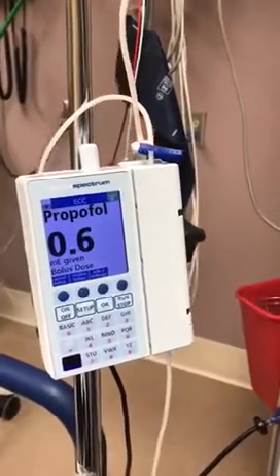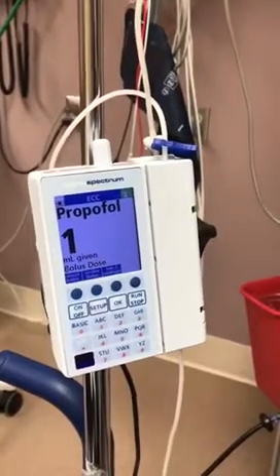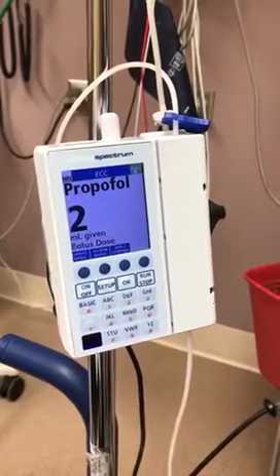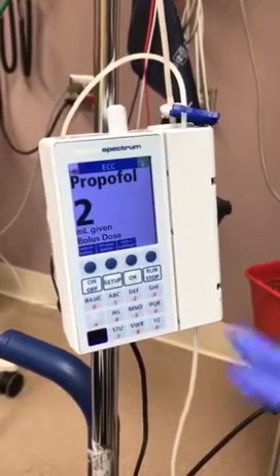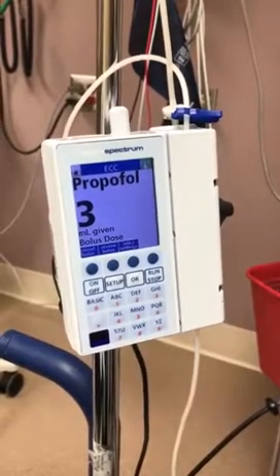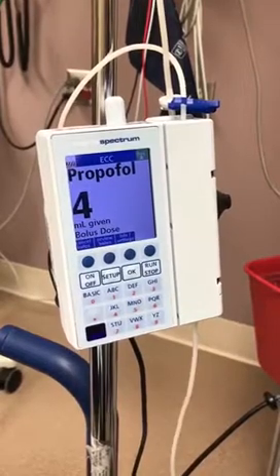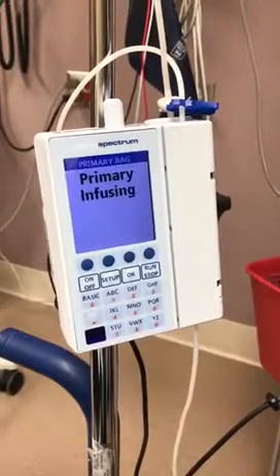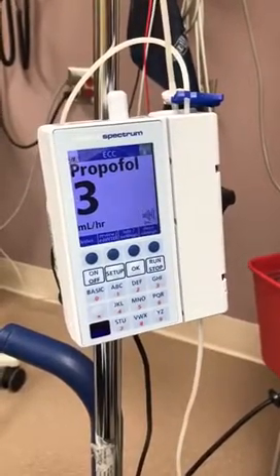You will now notice that the bolus dose will count up until the full desired dose is administered to the patient. Since this is an additional medication dose being administered to the patient, you must also document this bolus in addition to your already documented continuous infusion. In general, propofol oftentimes reduces blood pressure, so when we're administering the bolus dose of propofol, we will likely see a blood pressure reduction as well.